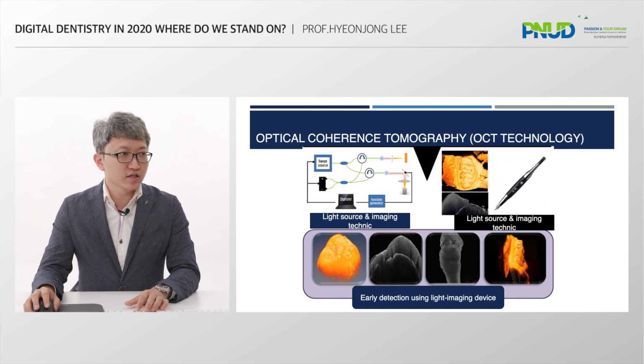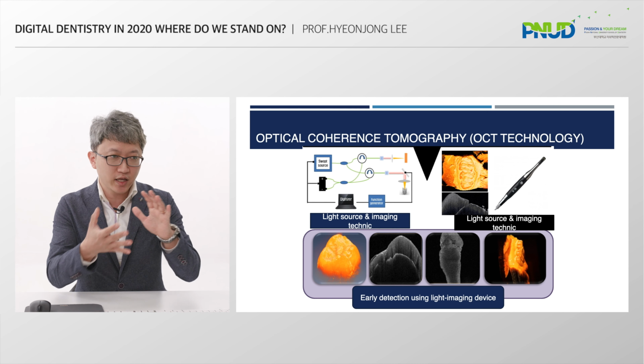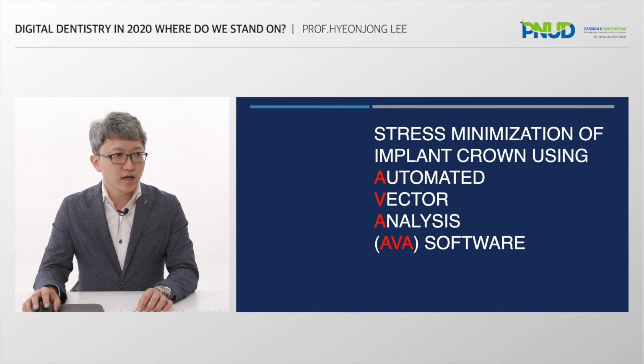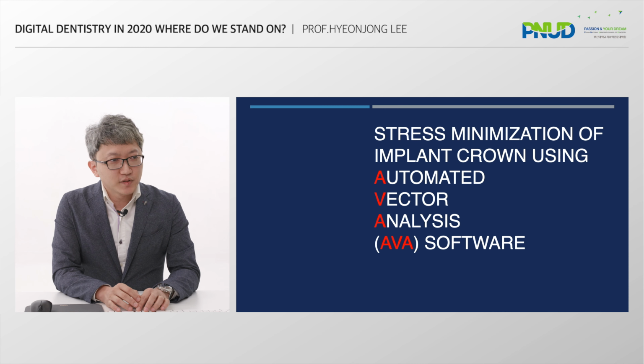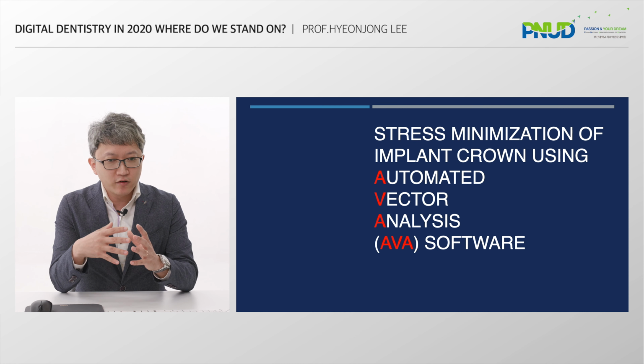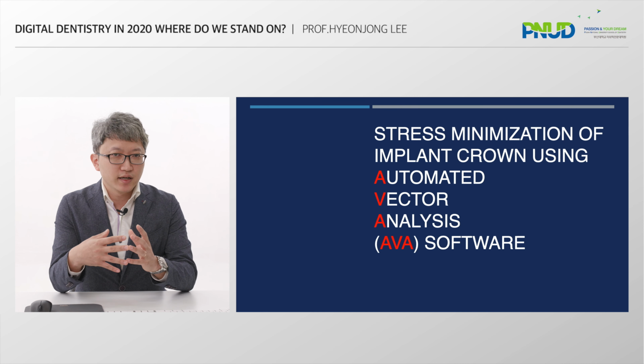But using this optical coherence tomography technology, we can see a three-dimensional image from 1 millimeter to 3 millimeter of penetration. I think this technique is really cool. So that was the innovation of the intraoral scanner aspect.